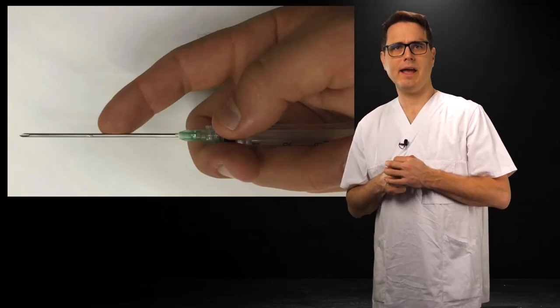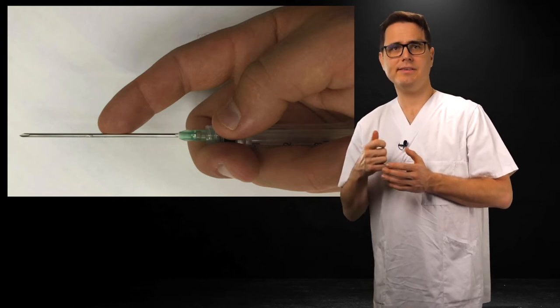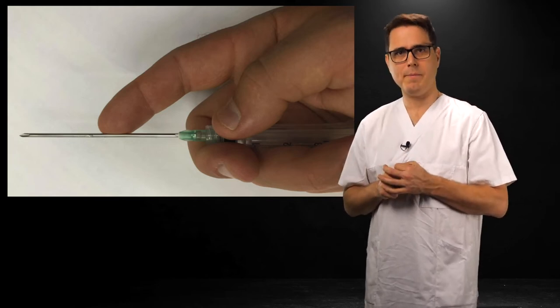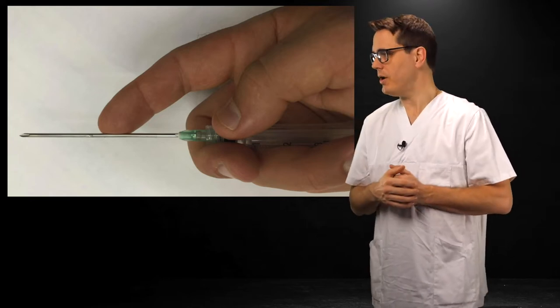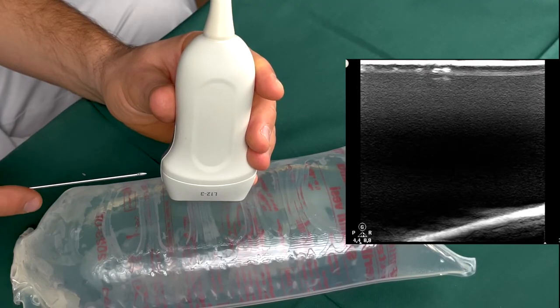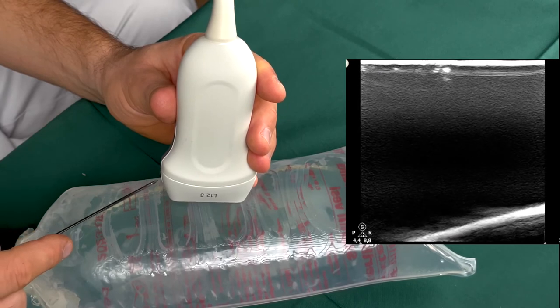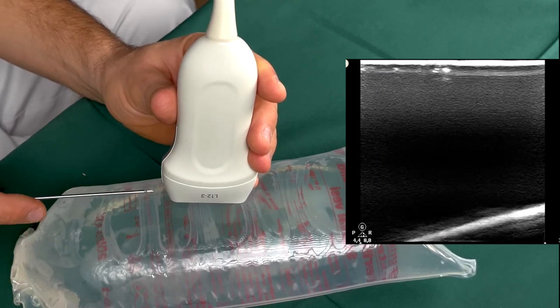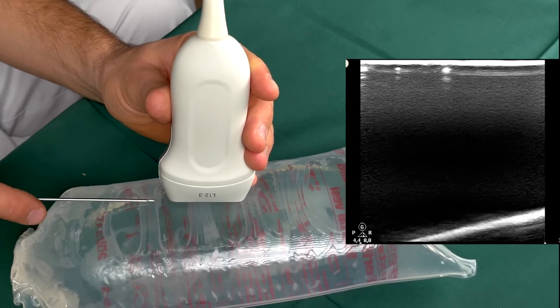Now pick up your cannula with an empty 2cc syringe attached to it — this serves as an improvised handle. Grab it firmly and place your index finger as shown for extra control. Align the cannula and the ultrasound field before you puncture the skin. So this is wrong, but this is good. The probe and the cannula should be like one unit at all times. Keep this in mind when you're tilting the probe.